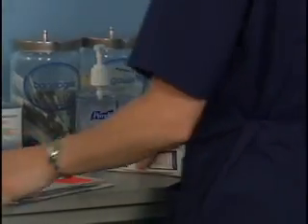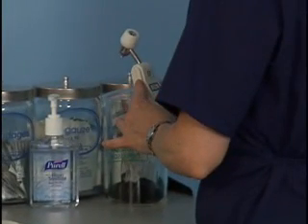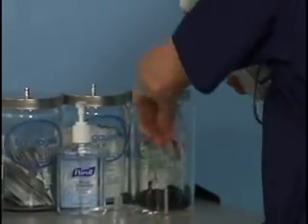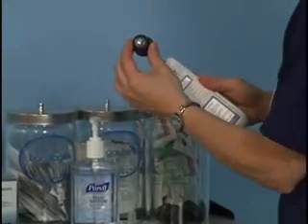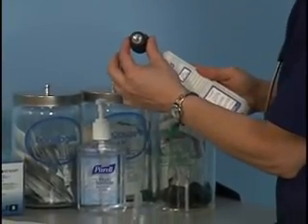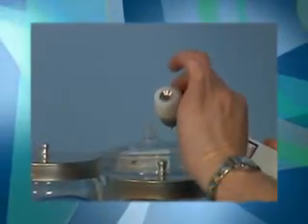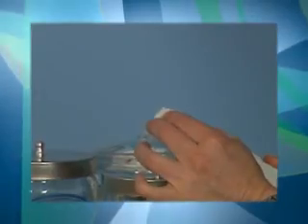Check the lens to be sure it is clean and intact. A dirty, damaged lens can lead to a falsely low temperature reading. Place a disposable probe cover over the probe to prevent the transfer of microorganisms from one patient to another. If the model doesn't use a probe cover, clean the probe with an antiseptic wipe and allow it to dry.